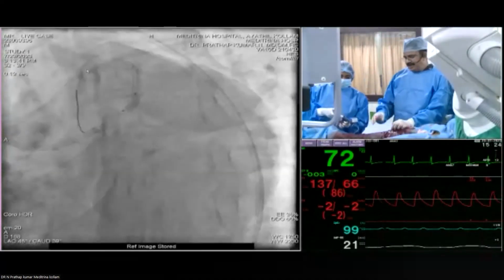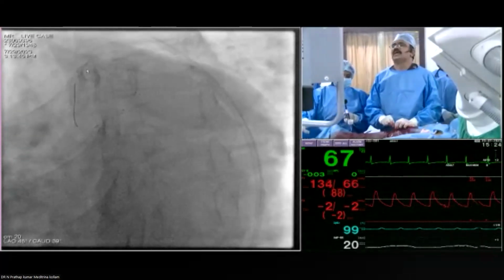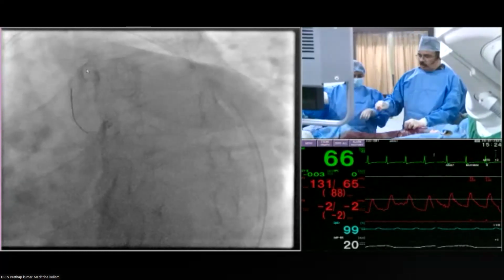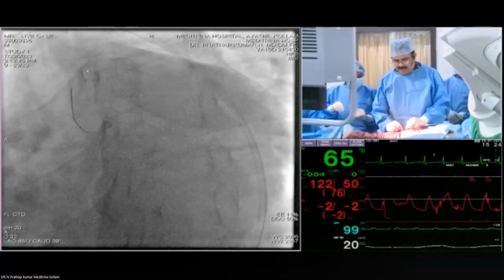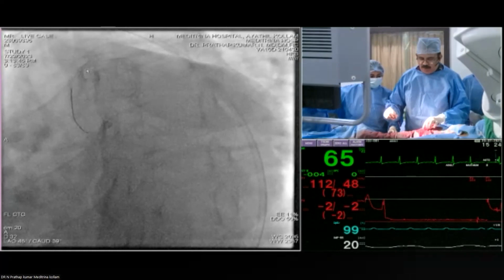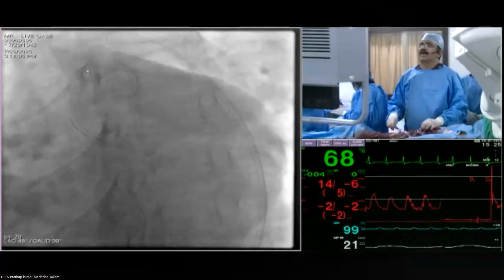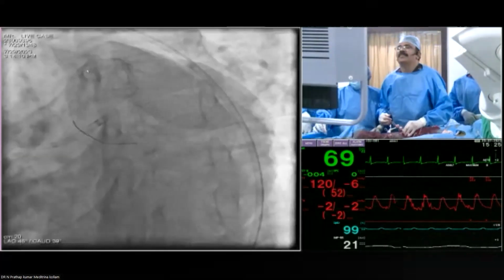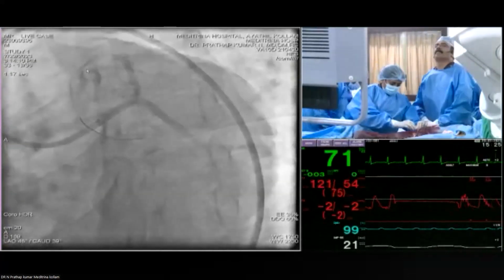That is actually correct. I did make a mistake there, and I should admit that. I usually check, and if there is a problem I go with a balloon, or another stent distally if there is a dissection I created. I usually do that. In the rush, I forgot to do that. Yeah, no problem. At the moment you immediately found that out, which is very good. So at the moment your stent in the circumflex looks nice.